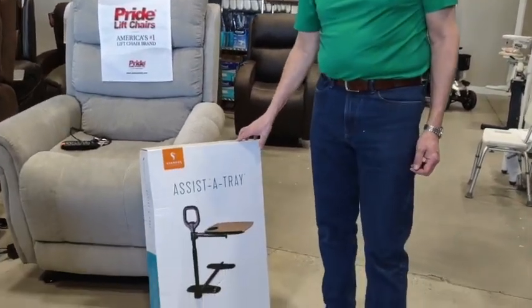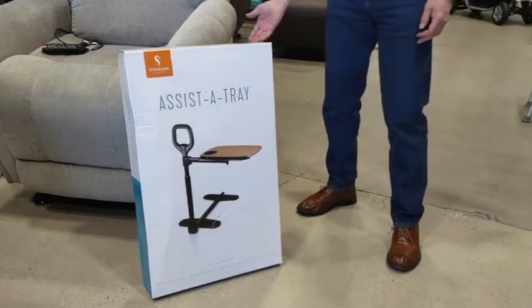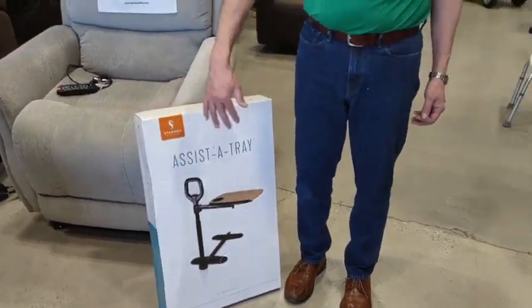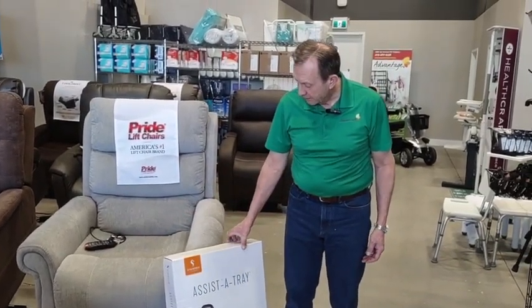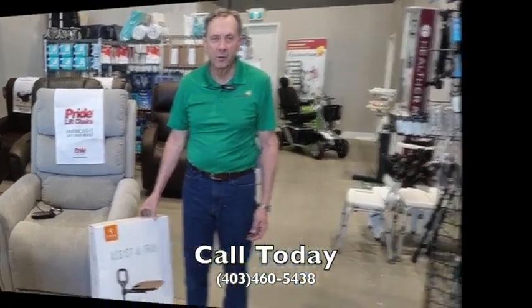A nice add-on for all lift chairs is an assist tray, and this just fits underneath the chair. This tray allows you to swivel it around in front of you, and it's just a really nice option. Stay tuned, but we might have this available for a promo for Father's Day.